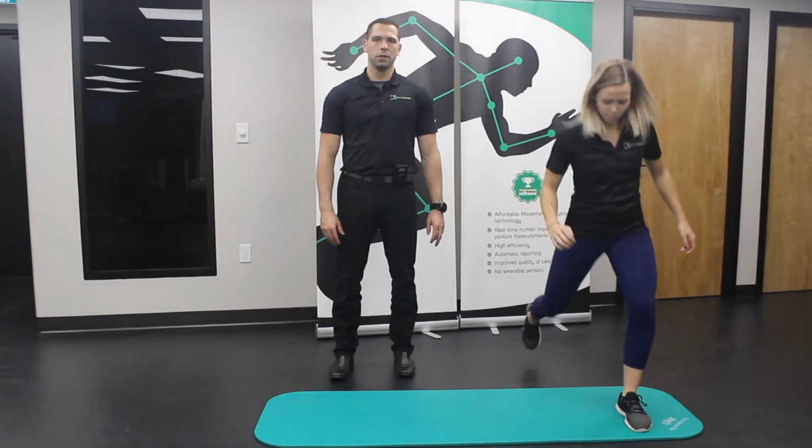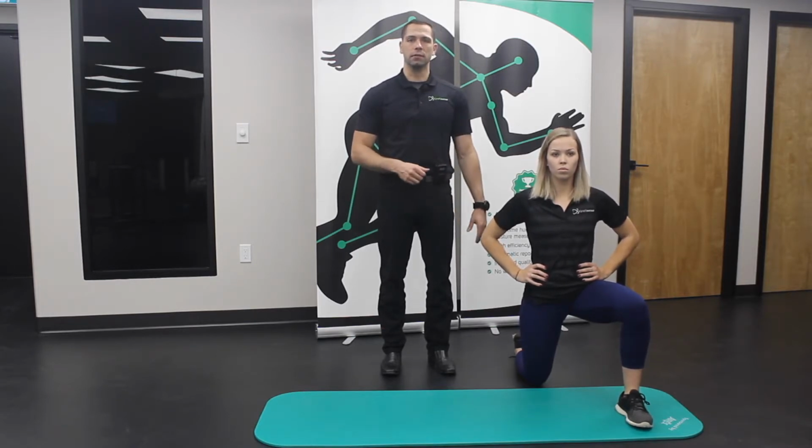I'm very excited to show you an advanced hip assessment protocol using the Kinetisense 3D range of motion capture system. When we're doing the advanced hip protocol for assessing the hips, what we're trying to do is lock the hip out in the sagittal plane and assess mobility in the frontal plane.